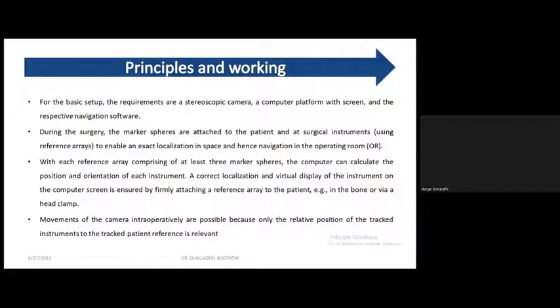One thing is very, very important. The position by which the patient is imaged at the time of CBCT, like pre-surgical imaging, the same position should be reciprocated at the time of surgery also in order to sync it, right? So for that, we need localizers. There are fiducials, localizers present, but I will show you in a video where nowadays localizer is also not needed. The software development is so much that even localizer is not needed nowadays.